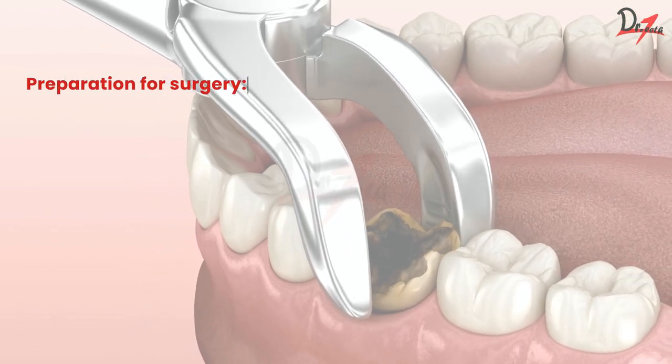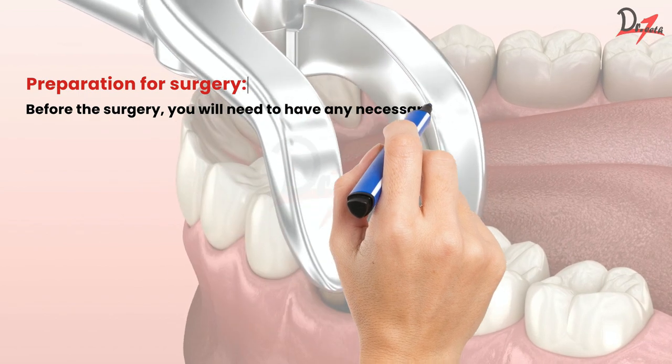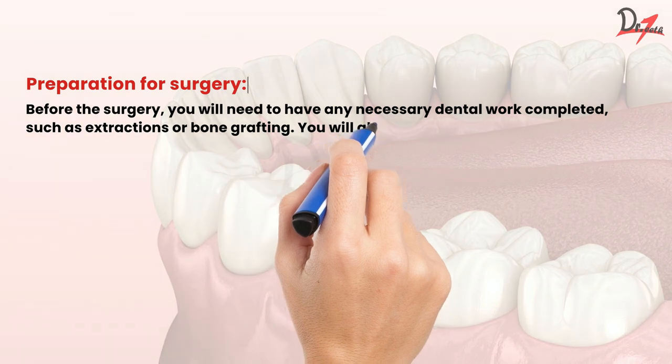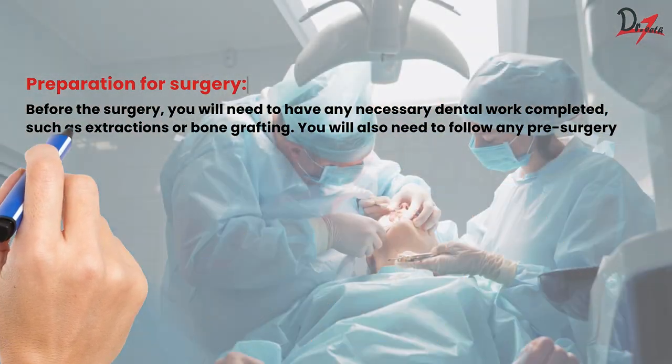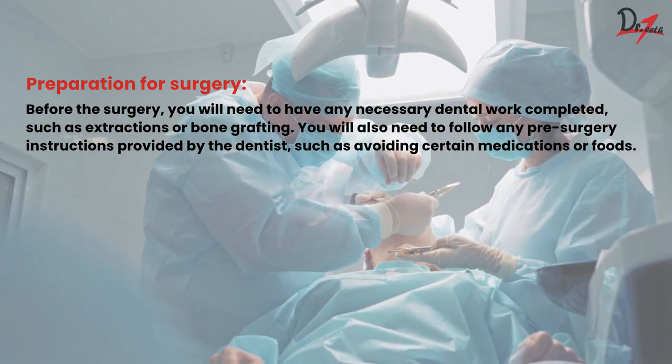Preparation for surgery. Before the surgery, you will need to have any necessary dental work completed, such as extraction or bone grafting. You will also need to follow any pre-surgery instructions provided by the dentist, such as avoiding certain medications or foods.